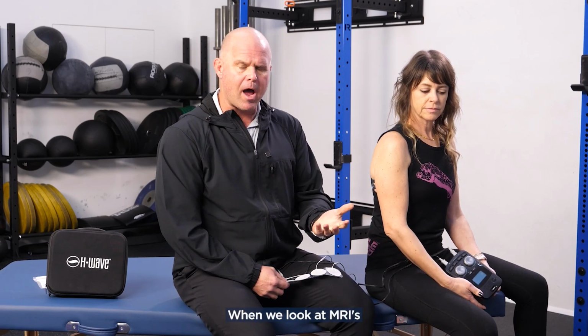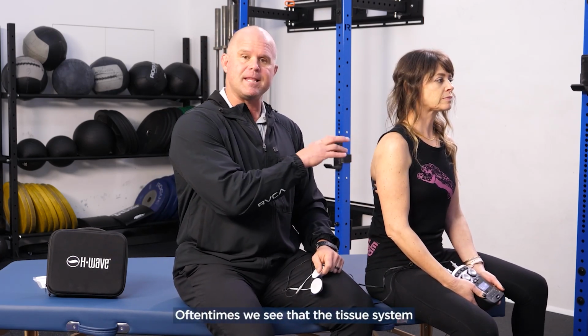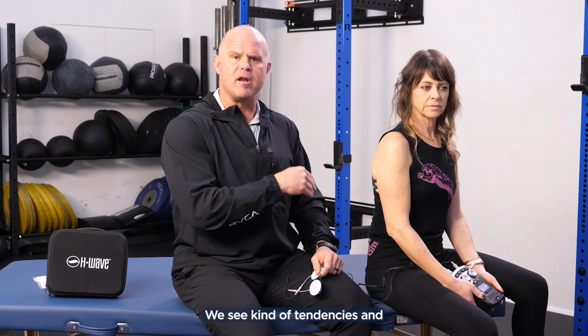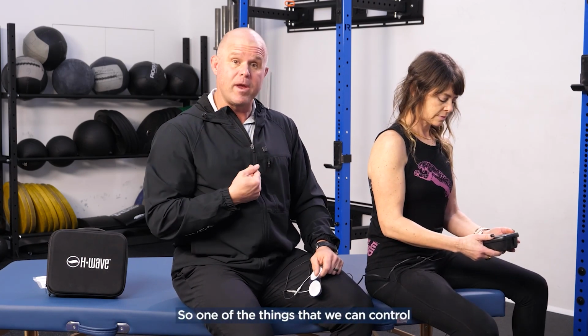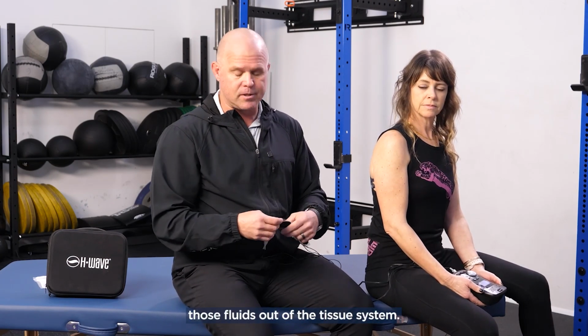When we look at MRIs and radiographic images and reports from people who've had shoulder pain and gotten a diagnostic image, oftentimes we see that the tissue system isn't very healthy. We see tendinosis and latent swelling. So one of the things that we can control very much is moving those fluids out of the tissue system.